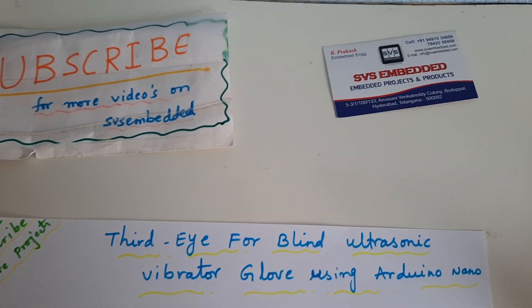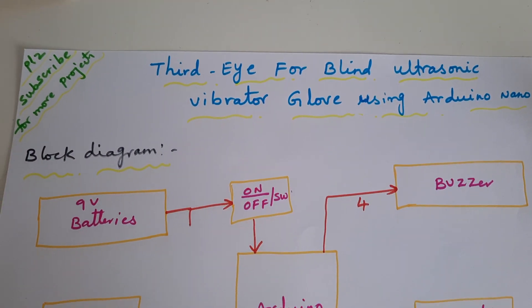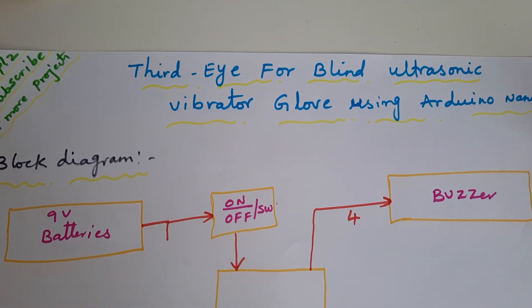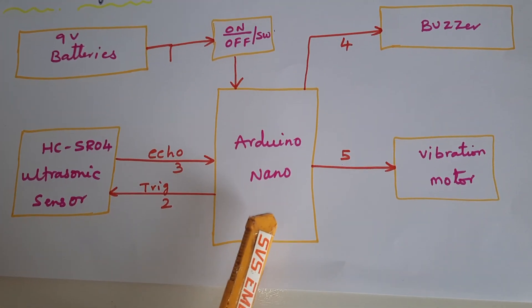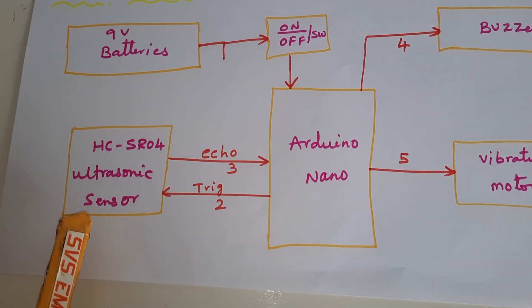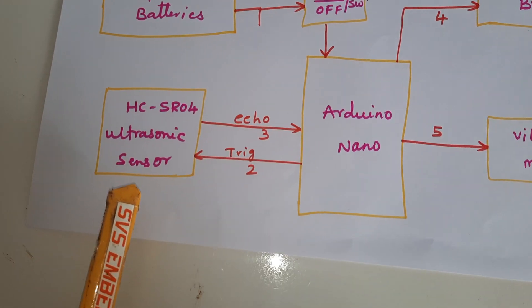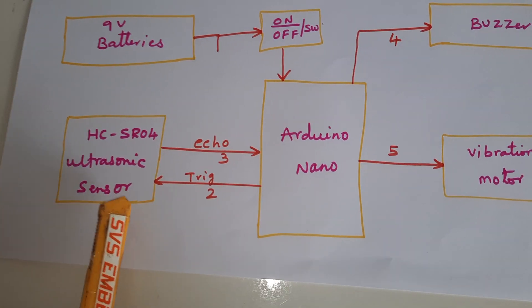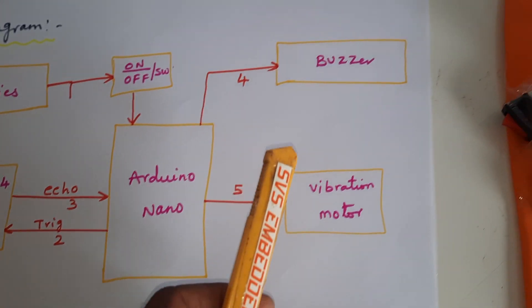Hi, we are from SVS Embedded. The project title is 'Third Eye for Blind' — an ultrasonic vibration glove using Arduino Nano. We are using the Arduino Nano and HC-SR04 ultrasonic distance measurement module. It can measure up to 2 meters distance, but we are setting a 50 centimeter threshold. If any obstacle comes within range, it will give a buzzer sound as well as vibration.